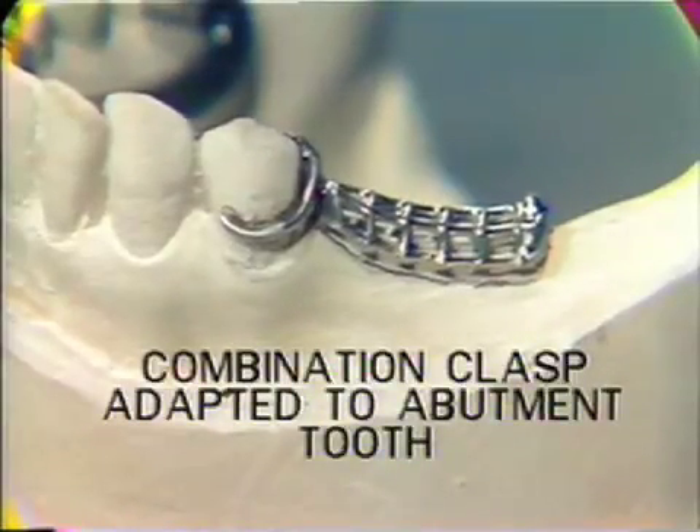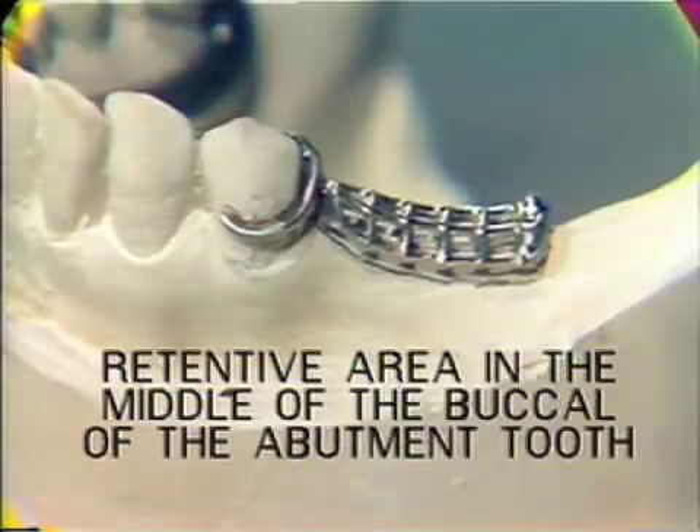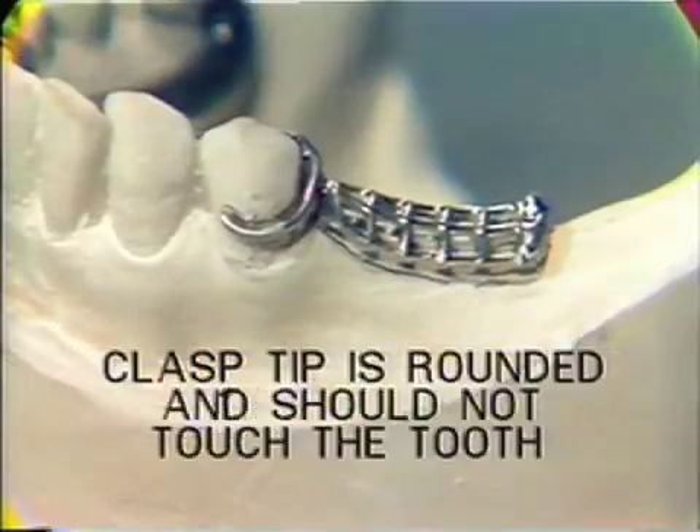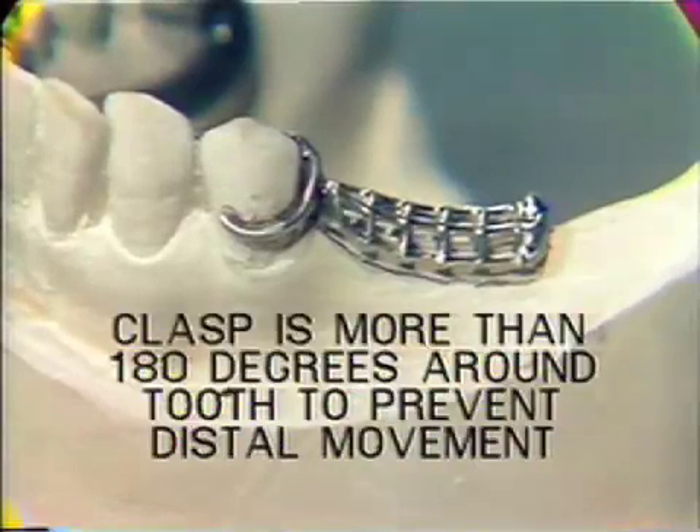Now let us review what has been done. First, the combination clasp has been adapted to the abutment tooth. Next, the retentive area is in the middle of the buccal of the abutment tooth. Next, the clasp should be away from the tooth at the distal buccal. Fourth, the clasp tip should be rounded and should not touch the tooth. Last, the clasp goes more than 180 degrees around the tooth to prevent distal movement of the appliance.